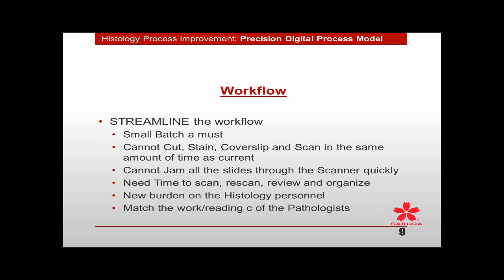So workflow is where you're going to have to start. You're going to have to make some decisions about what you want to do with this, but you've got to look at your overall workflow. I say small batches a must. Whether you start at processing or at cutting and staining, the further away from the scanner you start your small batch, in the steps prior to digital scan, the better you will be about how your overall workflow can be adjusted and stay within those defined time constraints.